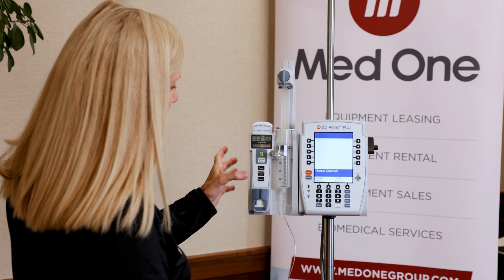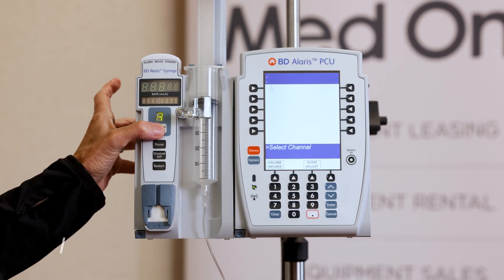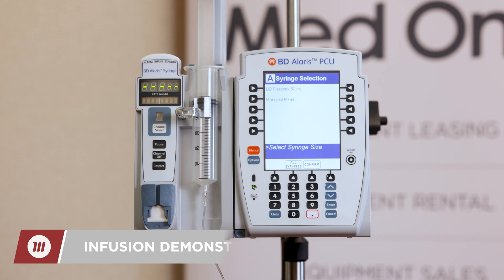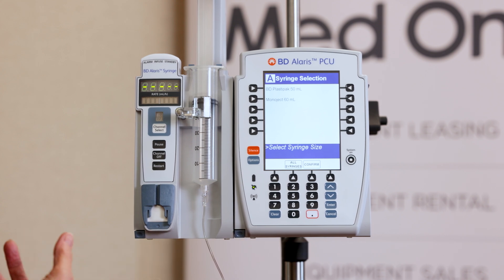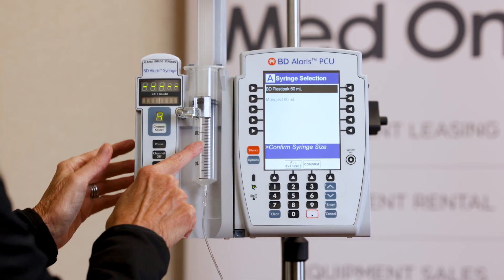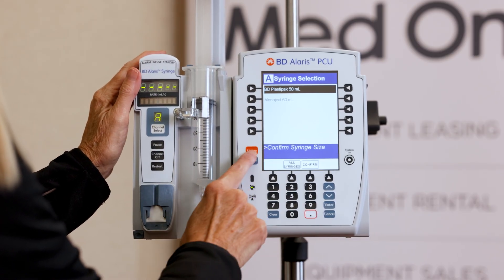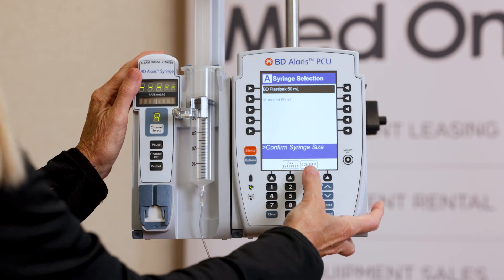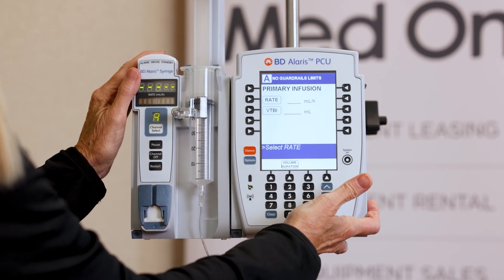I'll reach out to the white channel select button to activate. It recognizes Monoject, Terumo, and BD syringes. I'm going to select BD 50 because that's what I have loaded, and it says to confirm. Reading this rectangular prompt walks you through what to do each step, and now we're ready to program.